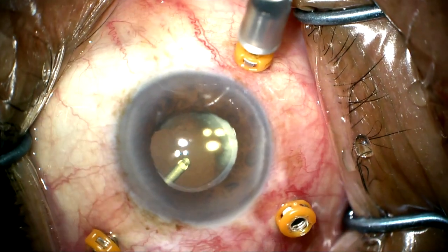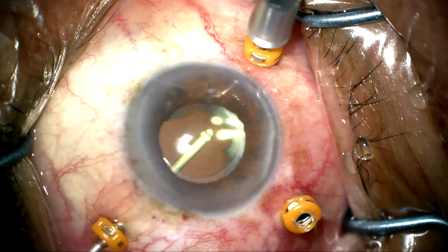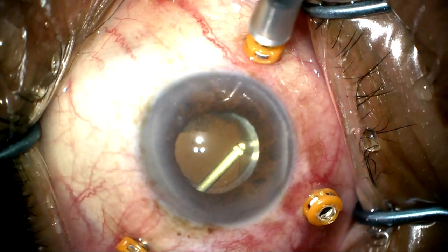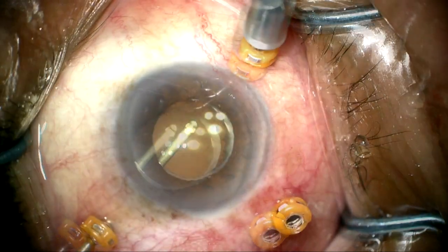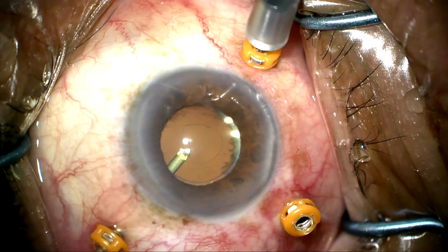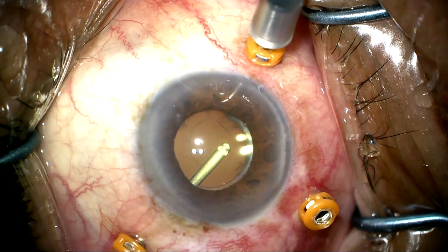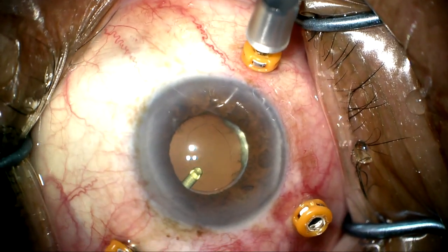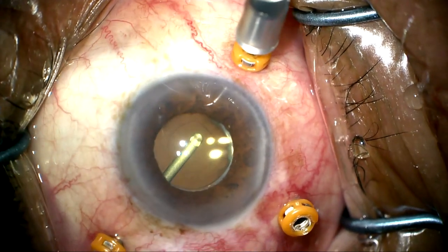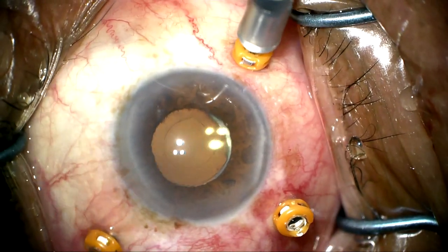I've decided to expand the posterior capsule opening into a vitrectorhexis using the cutter on high-speed vitrector to shape the posterior capsule opening into a nice round opening that will be less likely to cause any glare and to give me a little better access to the peripheral cortical material 360 degrees. So here you can see I'm shaping the posterior capsular rexis opening a little bit larger so it'll be less likely to cause glare and I have better access to the lens material.